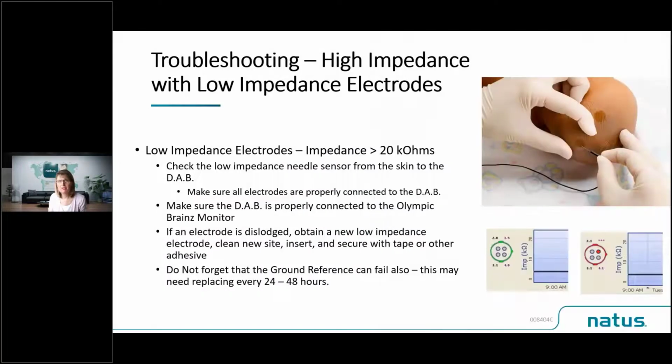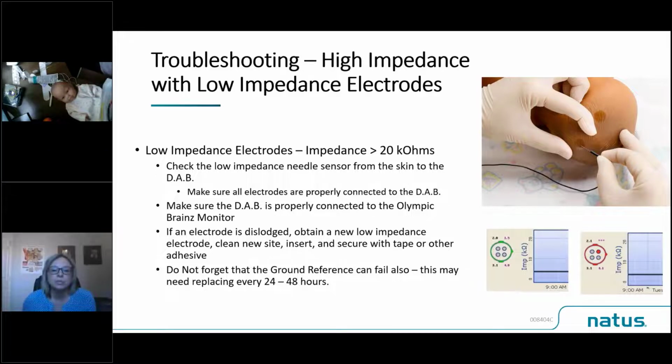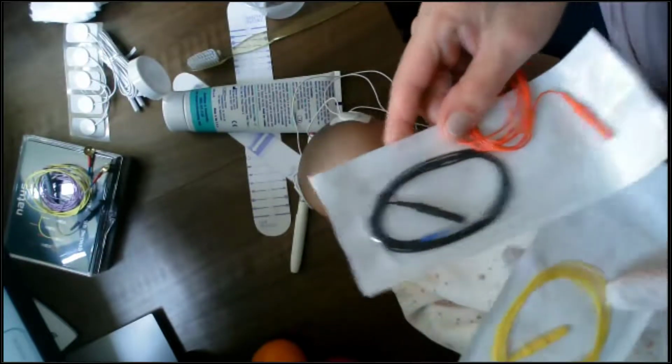So before we move on to cup electrodes, I'll do the same thing, and I'm just going to swap the camera again for a moment, and we'll just take a quick look at these needle electrodes and see what we can see with them. So needle electrodes, like I mentioned, they come in single packets. So you would get a box of kind of 24. And you would have all sorts of different colours in there. I'm going to stop sharing my screen. So I have my packets.